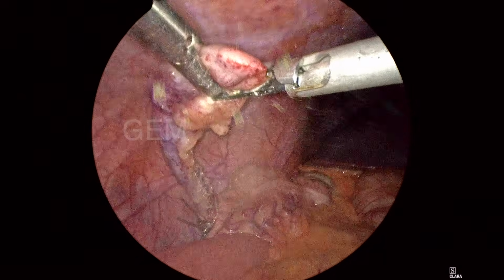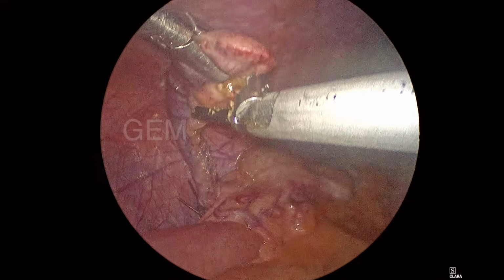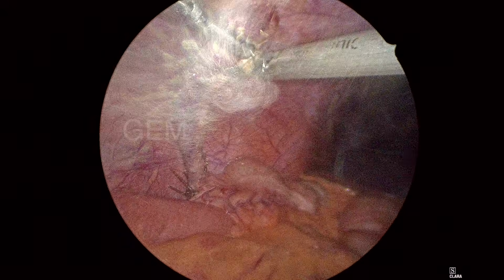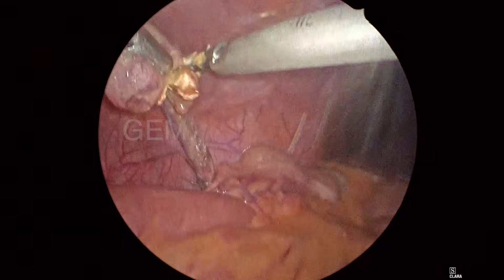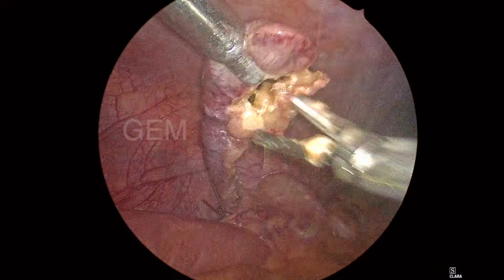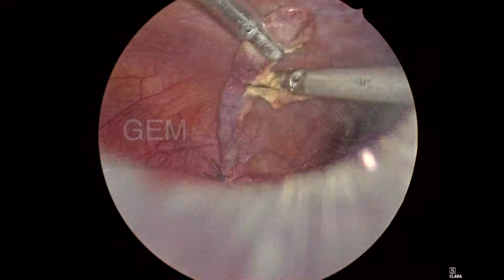The tip is a little bit thicker, so it will not come through the 7 mm trocar. The mesoappendix is also edematous there. So I'm dividing the mesoappendix so that I can take the appendix out through the 7 mm port, avoiding the 10 mm incision at the umbilicus.